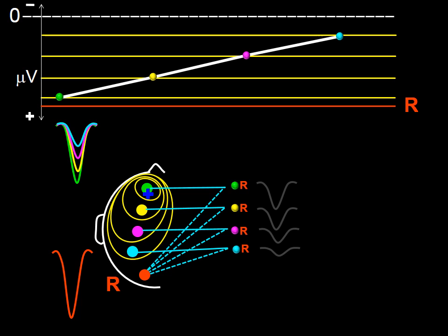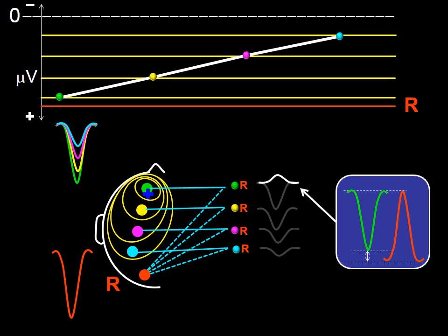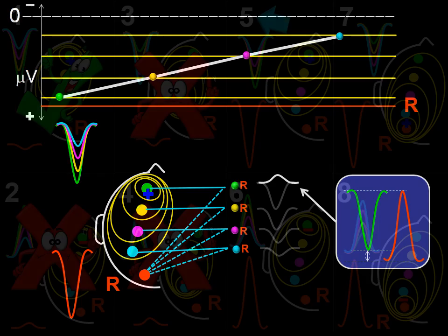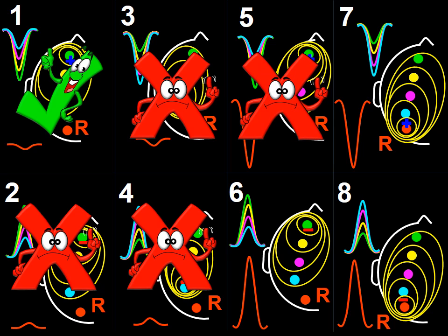The gray waves, as in the previous frames, indicate the waves in question. I have introduced the blue box and the corresponding wave after the activity that takes place in the differential amplifier. As you can see, the wave doesn't correspond with the one in question arising from the first derivation. So option 5 is not a sound option.